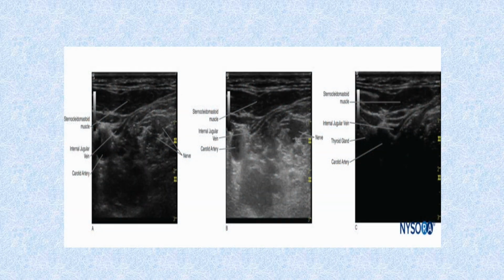So this is an example of how we utilize gain. If your image is too dark, you can increase the gain. You want to see maybe this structure here. But then sometimes you adjust too much, and the image in the center becomes too bright. So then you adjust back, and you get the optimum gain that you want. You can review the structure, but not too bright.